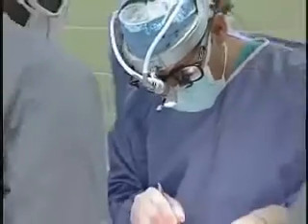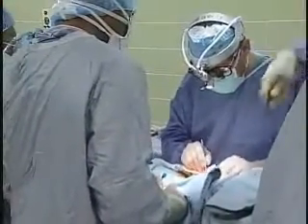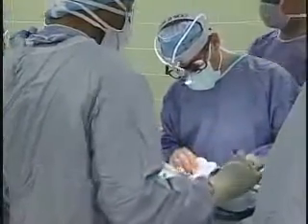In many cases, patients at risk of a heart attack require surgery to implant a defibrillator. The problem is there's a 3-month waiting period to safely implant the device. Most of those patients have their lethal event during that time period when they're waiting to get their implantable defibrillator. And that's where this device comes in and is a brilliant idea.